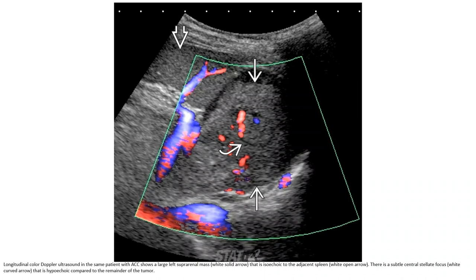This is color Doppler ultrasound in the same patient with ACC, showing a large left suprarenal mass. There is isoechoic signal relative to the adjacent spleen. The central stellate focus is hypoechoic compared to the remainder of the tumor.